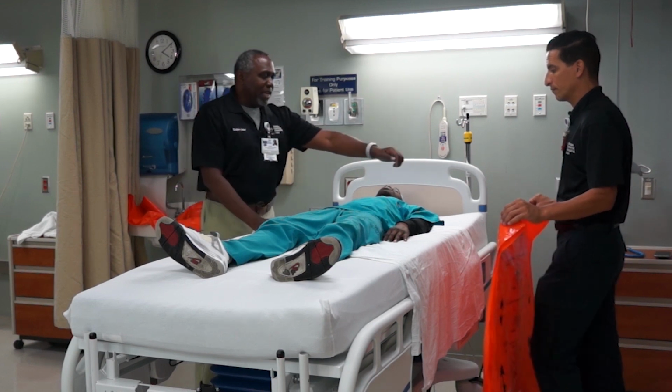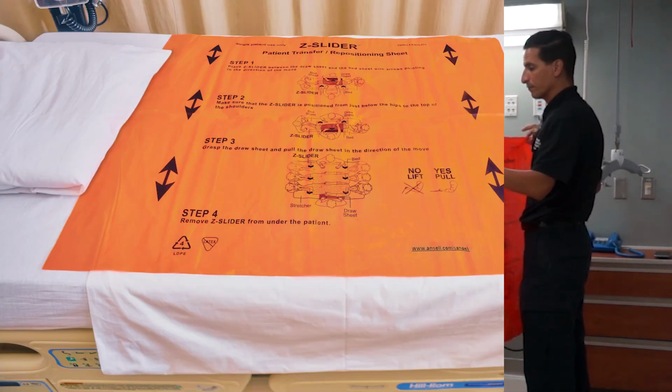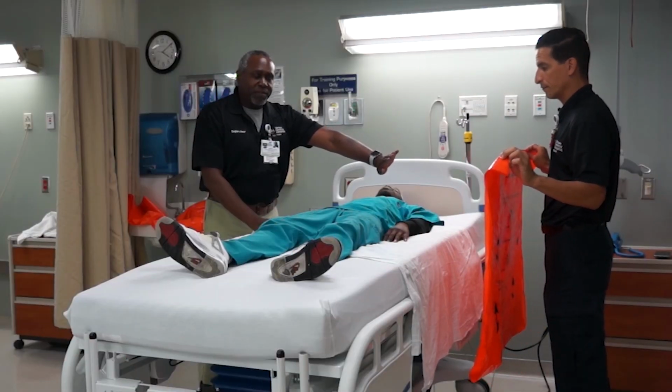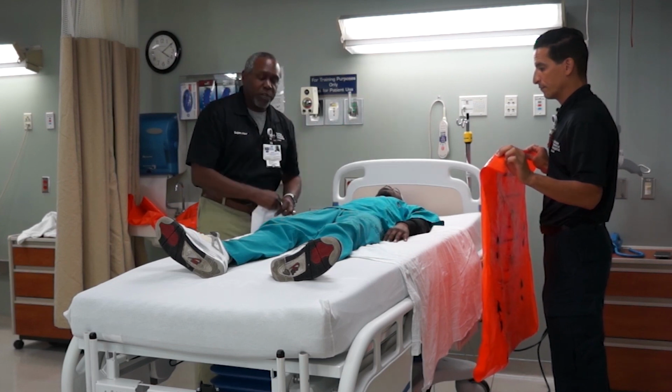What we're going to be doing is getting the Z slider. The arrows are going to be pointing laterally, sideways on the patient, so that we can get underneath the draw sheet, shift the patient as far as we can to one side of the bed, and then a bicep curl to get the patient turned. We'll explain more in detail as we do it.